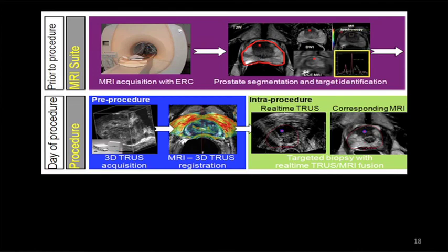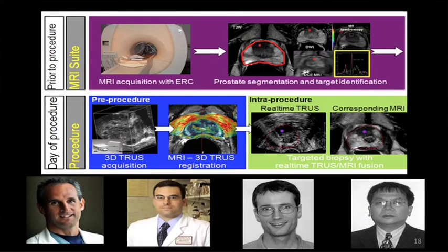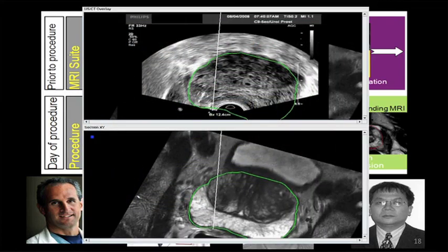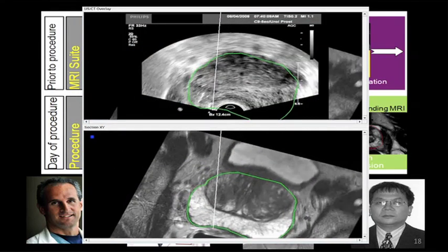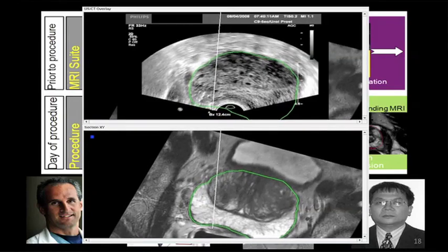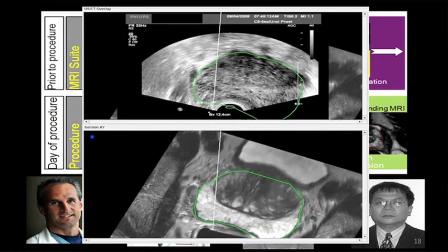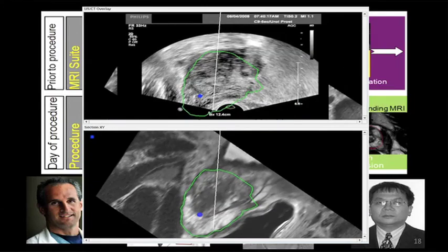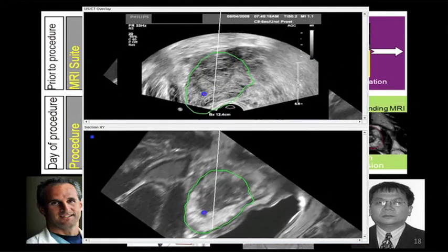The system basically utilizes the medical GPS. And here are the inventors of this system. And we are working with Philips to build up this system. And this is a sample video. I mean, the benefit of this system is that many lesions in the prostate are not visible on ultrasound, but visible on MRI. Doing these biopsies in the gantry is quite tough. So this system brings MRI into the office space.